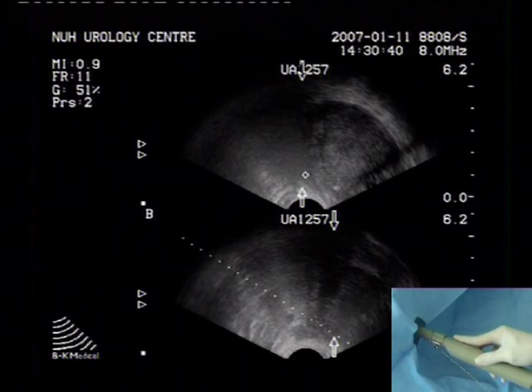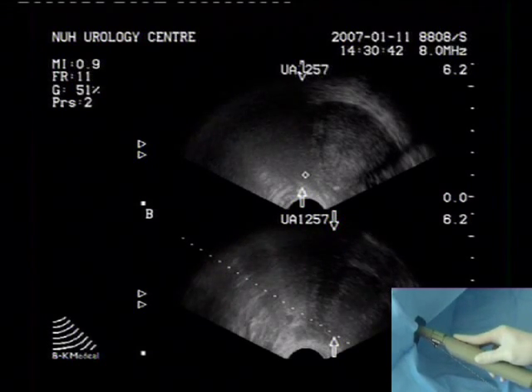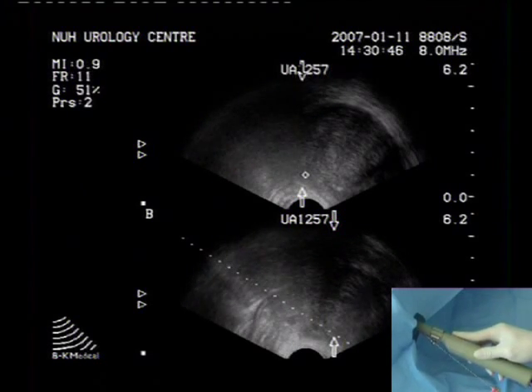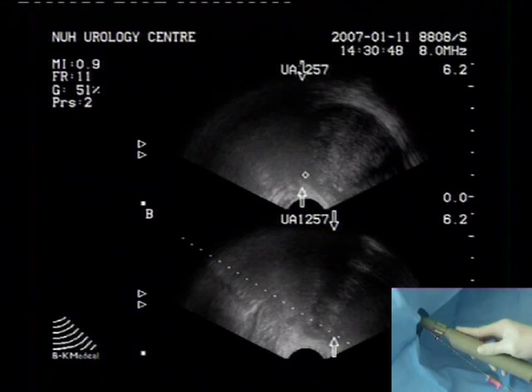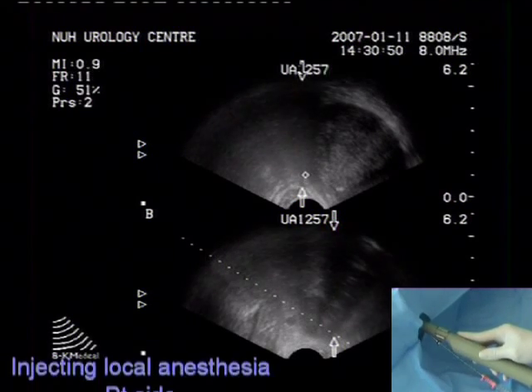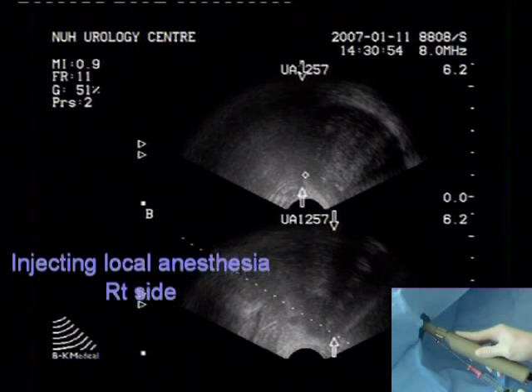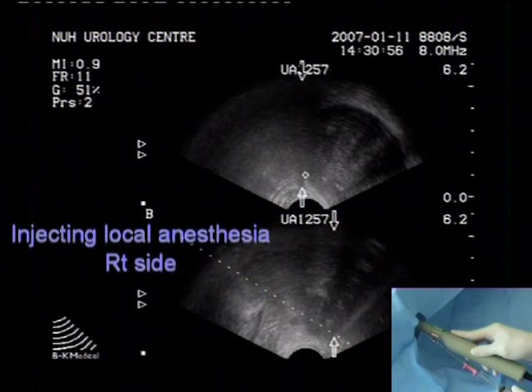The injection needle is passed through the transrectal ultrasound biopsy needle port and the tip is positioned at the base of the prostate at the junction between the prostate and the seminal vesicles. Simultaneous transverse and sagittal views of the prostate facilitate correct positioning of the needle tip.